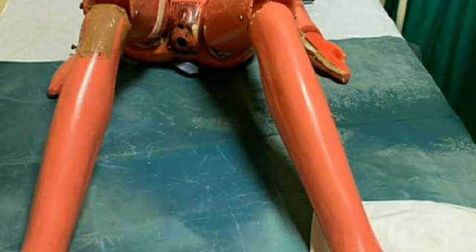Perform hand washing. At first, put an absorbent pad or Macintosh under the buttocks of the patient. Positioning the patient: place the patient in dorsal recumbent position with knees slightly flexed and feet about 2 feet apart.